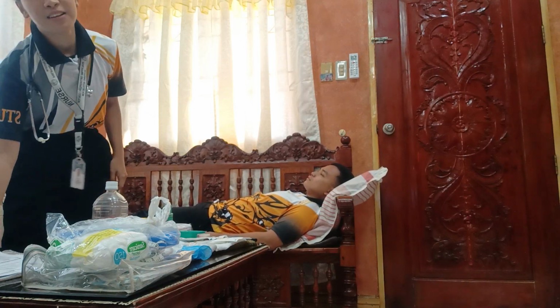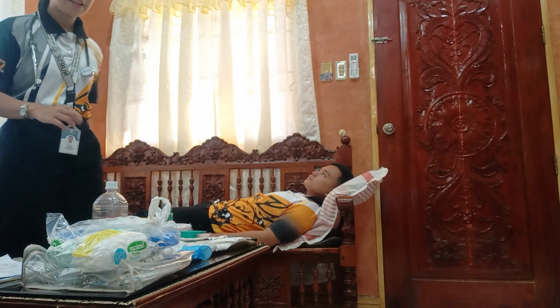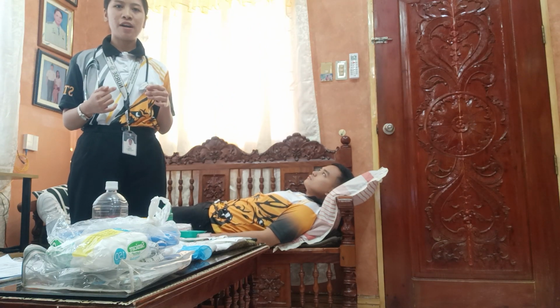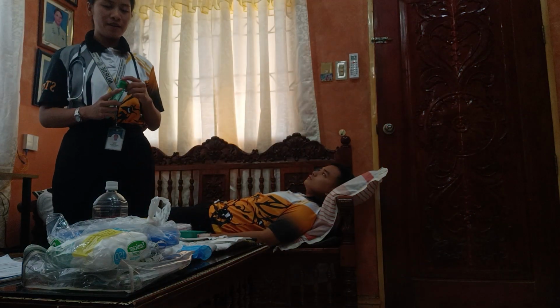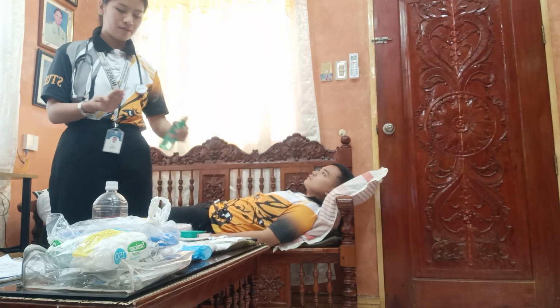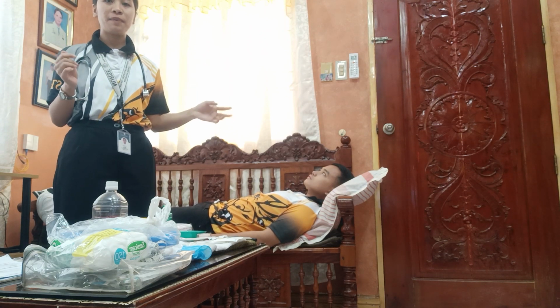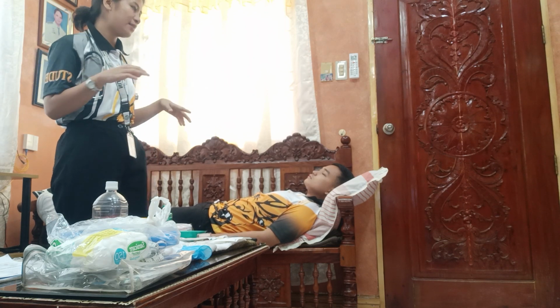Okay. And after that is perform hand hygiene and put on PPE if indicated. Hand hygiene and PPE prevent the spread of microorganisms. PPE is also required based on the transmission precaution. So I will use the 70% solution of isopropyl alcohol. After that is identify the patient. So identifying the patient is to ensure the right patient receives the intervention and to help prevent error.